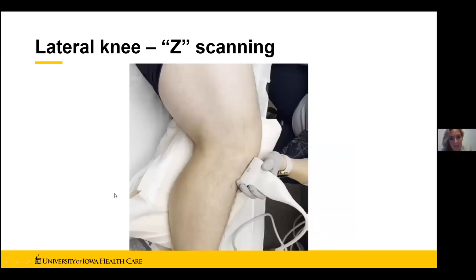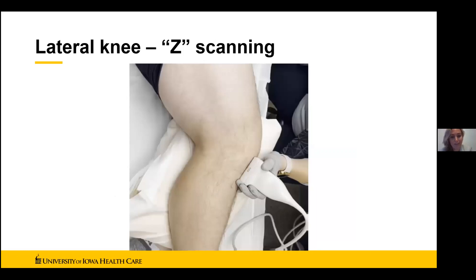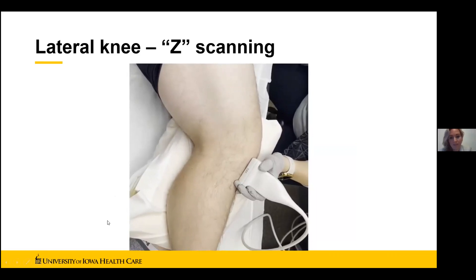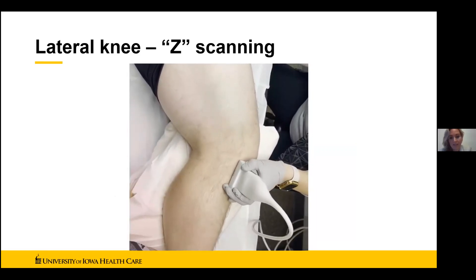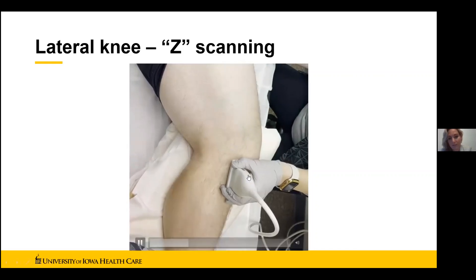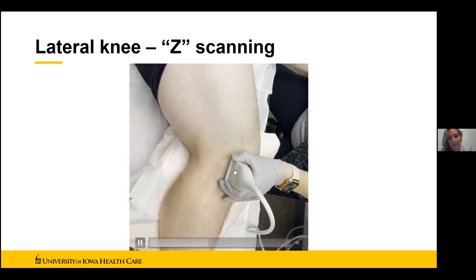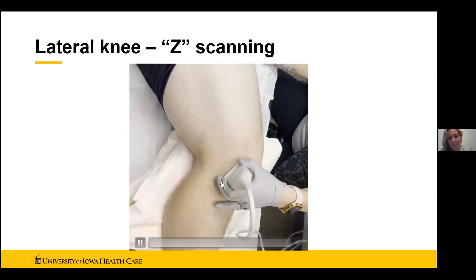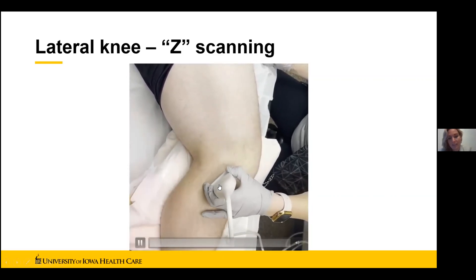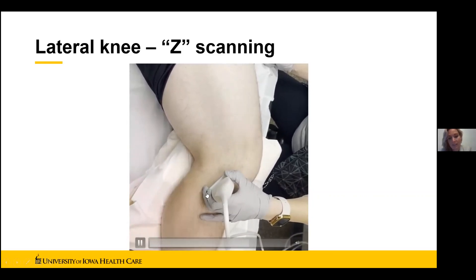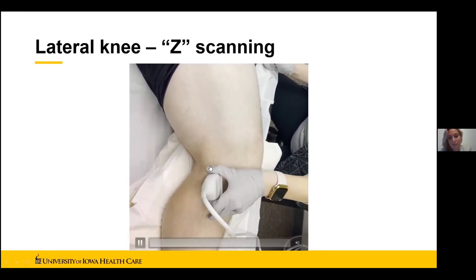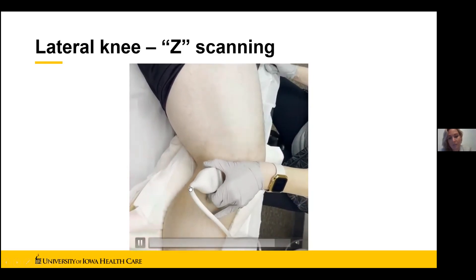Putting this into practice with our athletic trainer student who let me take this video, we can see the Z scanning maintaining all lateral or long axis views — going with the patellar ligament first, now over the IT band, then locking the proximal end and rotating the distal end to the fibular head to see the LCL, and then locking the distal end and rotating up to see the biceps femoris.